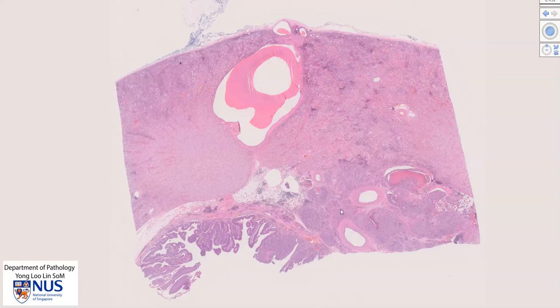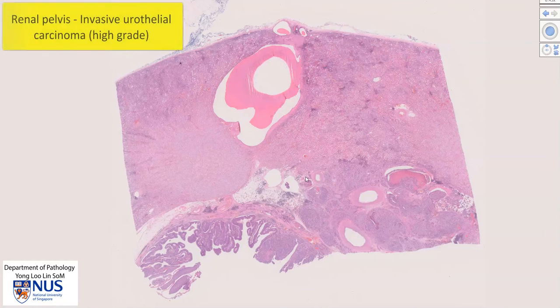This is a virtual microscopy slide showing a case of invasive urothelial carcinoma involving the renal pelvis and also invading into the underlying kidney.